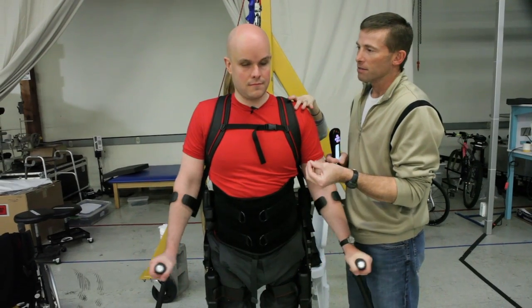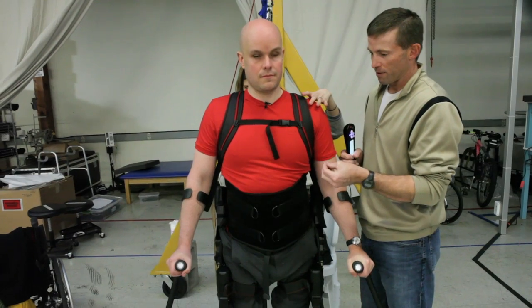The key here is don't try to walk the device, just balance it, find that sweet spot. If you do that, the rest of it will be fine.